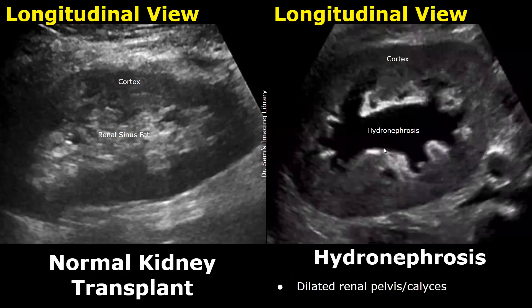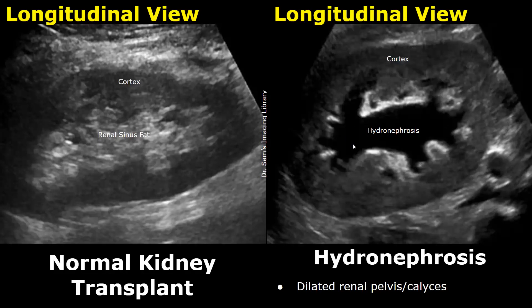Now we will compare the normal images with pathologies. The first case is hydronephrosis, in which we will find dilated renal pelvis and calyces. Depending on the extent of hydronephrosis, the appearance in a transplant kidney is similar to that of a native kidney.